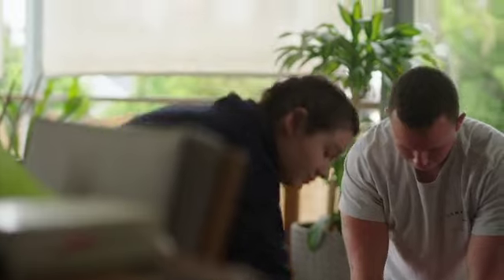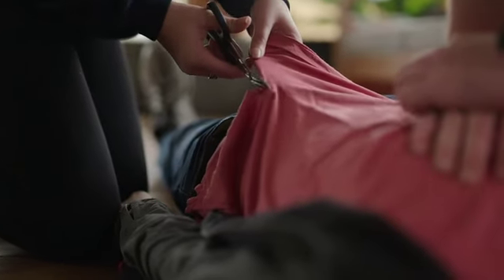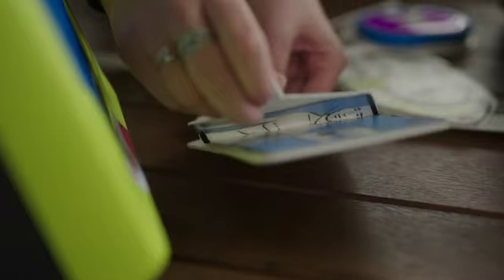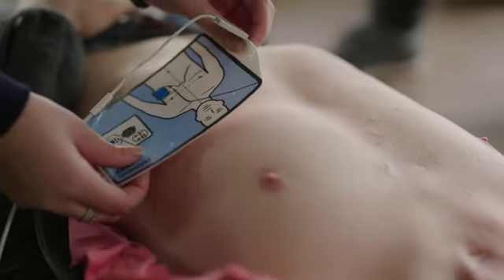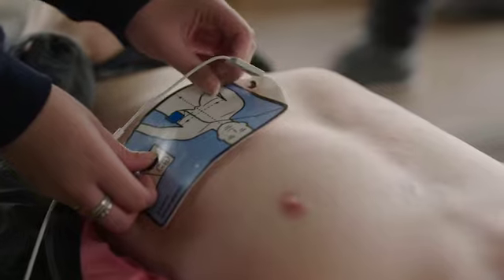If they're not breathing, and we've established now that they're unconscious and not breathing, then we need to begin cardiac compressions, CPR on the chest, immediately at about 100 to 120 per minute. Now remember, get your defibrillator that's close by as well, and get a defibrillator onto your patient as soon as you can. When you're doing your compressions, the defibrillator will actually have a metronome, a beeping sound that will guide you through doing your compressions.